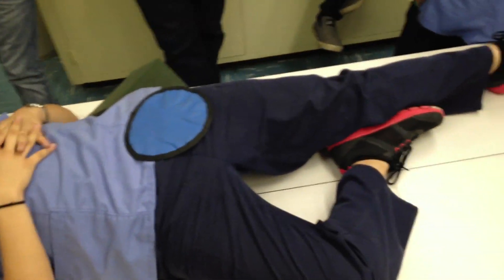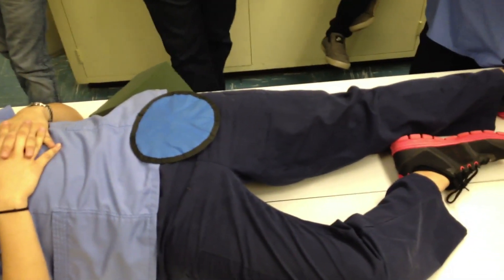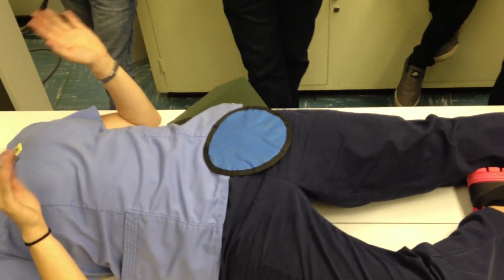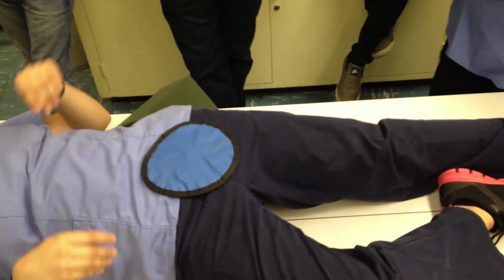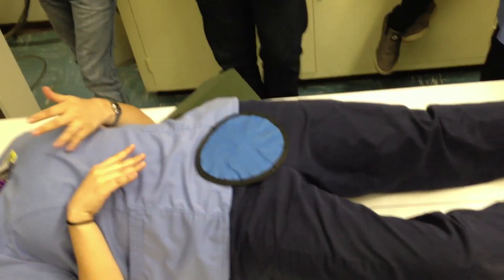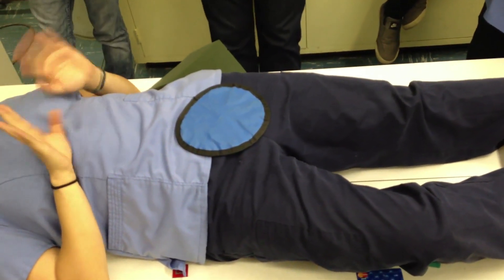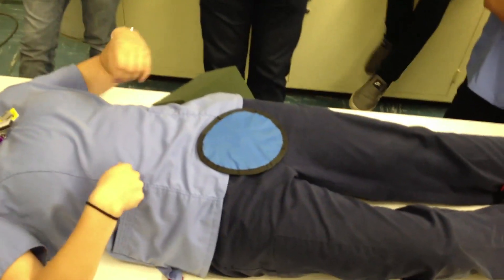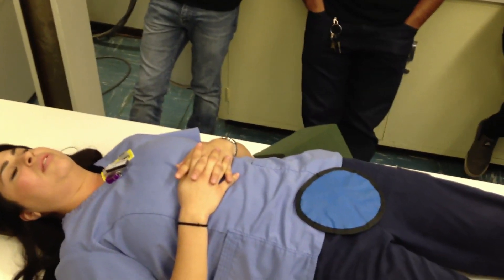If you have them remove their pants, can you still put a blanket or sheet over them? Yes, you should. Always make your patient feel modest. Keep in mind a lot of men will say 'I'll just pull my pants down,' but then their pants are stuck at their ankles and you can't turn their legs out. So you're better off getting them in a gown. For women especially, make sure to double gown your female patients regardless of what exam — one open in front, one open in back. If they're tall, use two gowns. Make them feel comfortable, because if the patient feels awkward they won't cooperate as well.